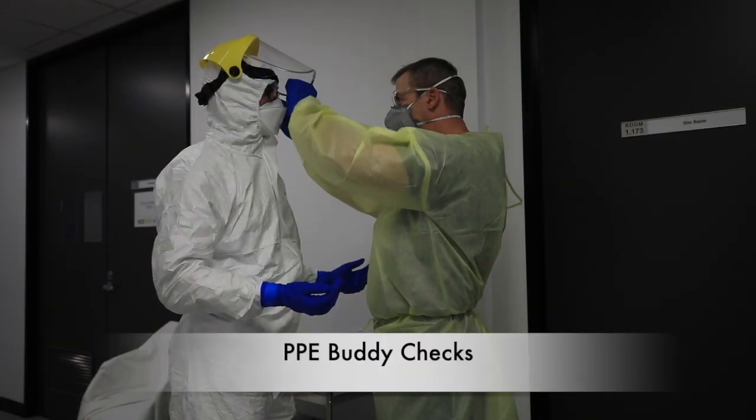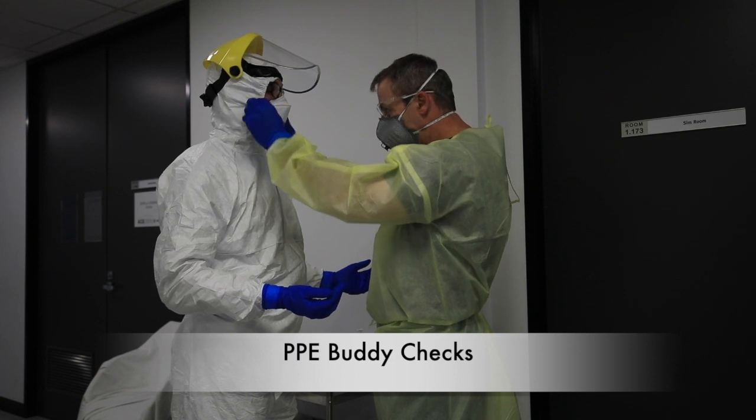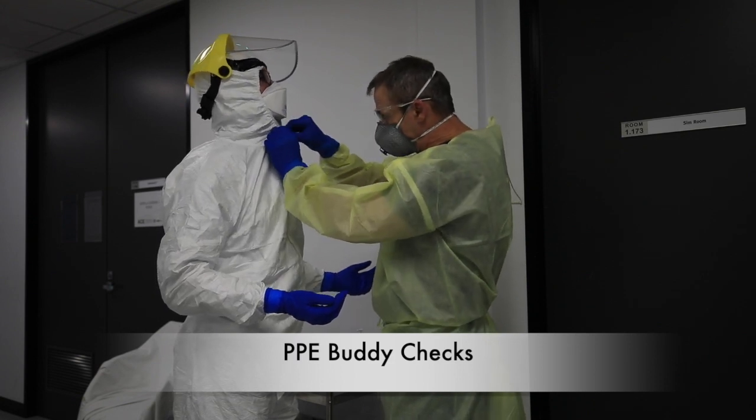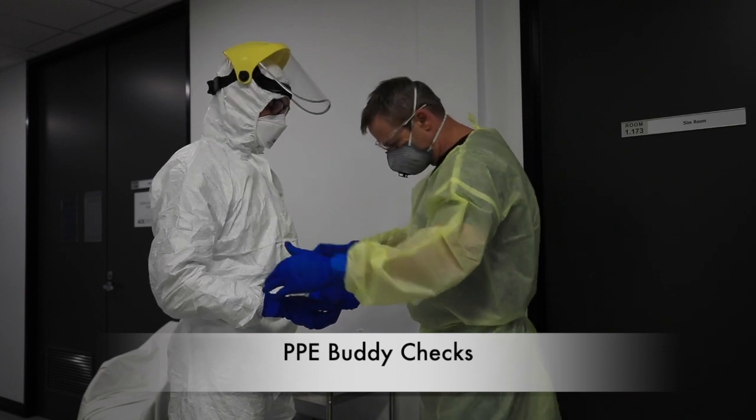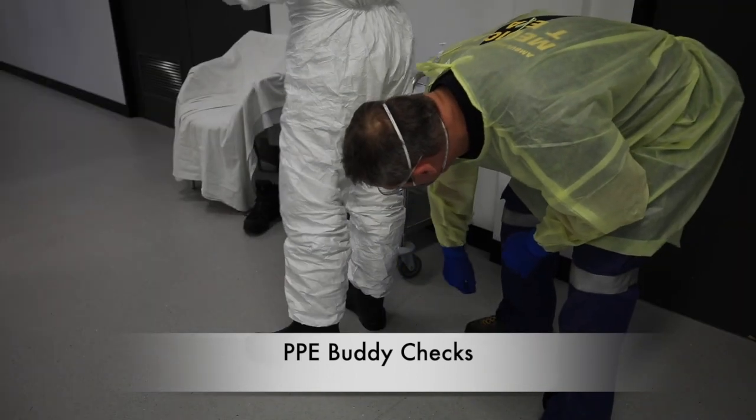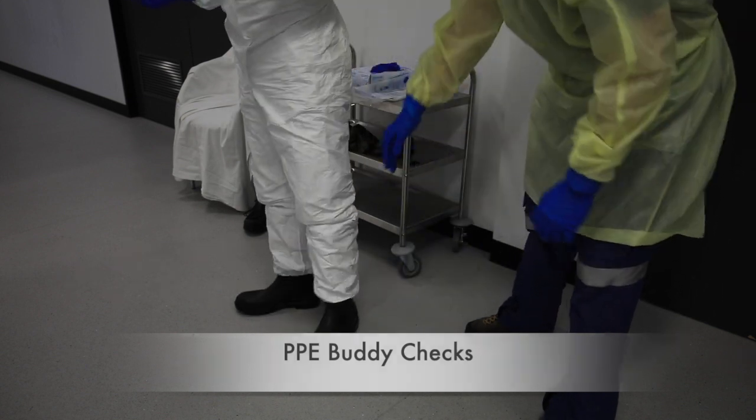Go — doing the body check now. No gaps here. Good seal. Cover your mask. Zipper's up. Gloves over your cuffs. Legs are down. Boots are covered. No openings visible.